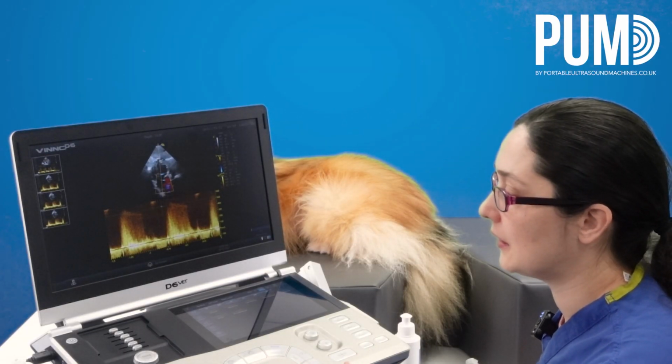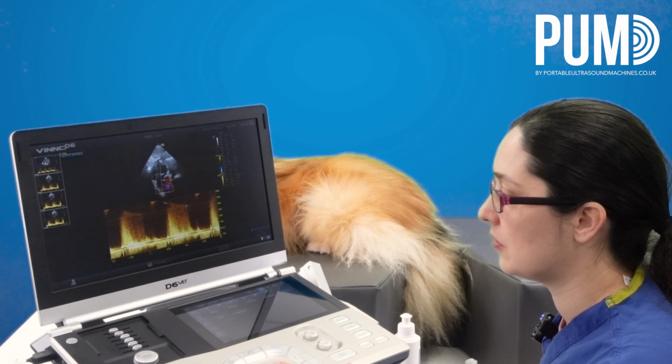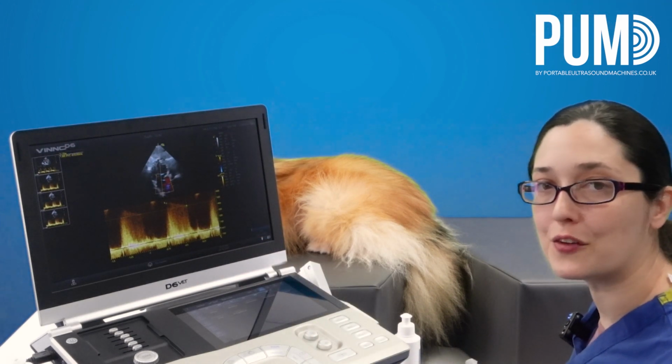To do my calculation, I can just place my point at the maximum, fit my gradient properly, and it's giving me my pressure half time at the top there.